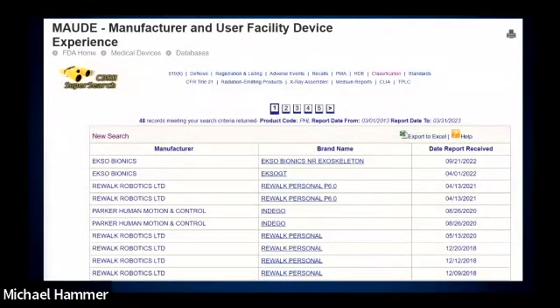I was quite strategic. So instead of plugging in a wheelchair manufacturer or cushion manufacturer and showing all the adverse events that pop up, I went to the exoskeleton industry, right? Just to be safe. Because again, this is not about calling anyone out. It's not about punitive action. It's about learning from what went wrong and what happened. And so all of these devices are entered by product codes. There's lots of different ways to search. There's great tutorials online. They've got YouTube videos. They've got step-by-step strategies. It's easy to learn how to manipulate this database.